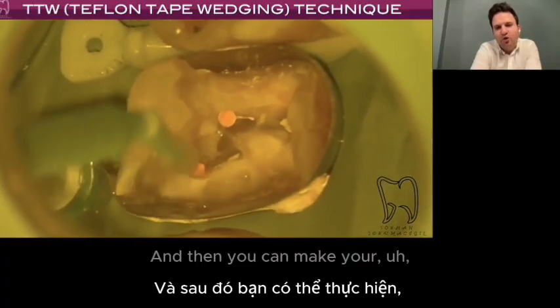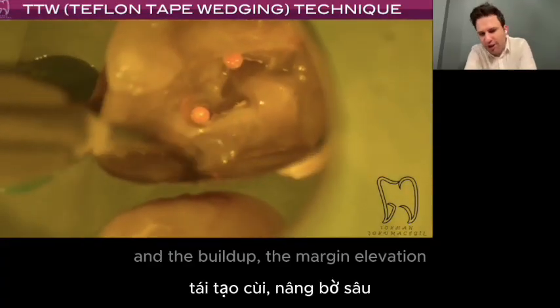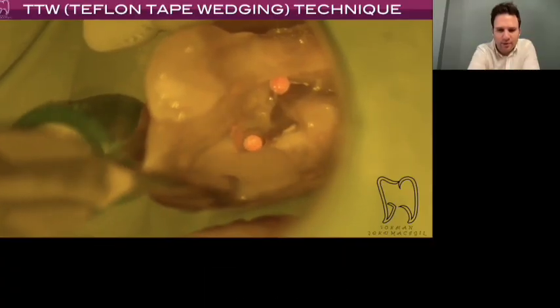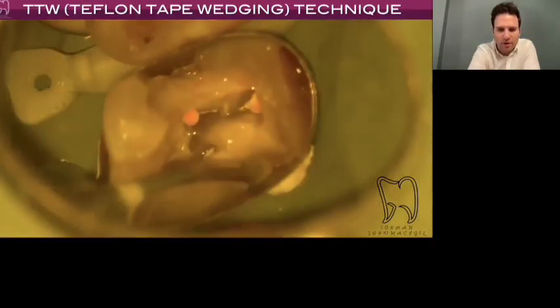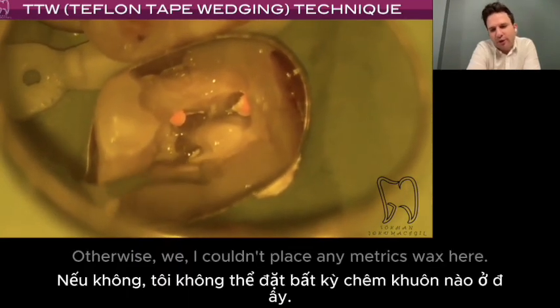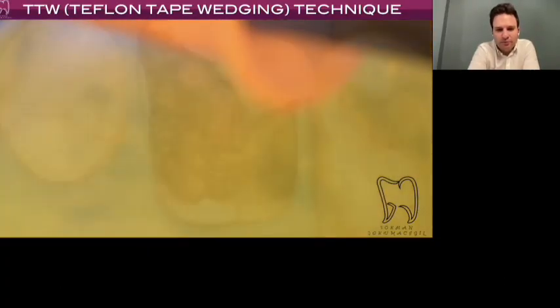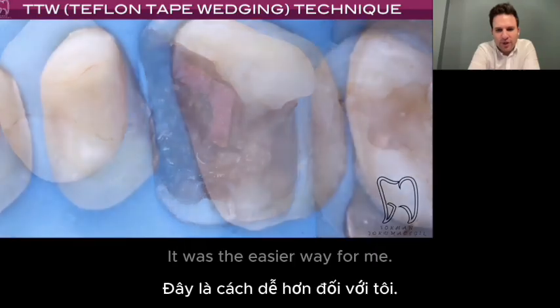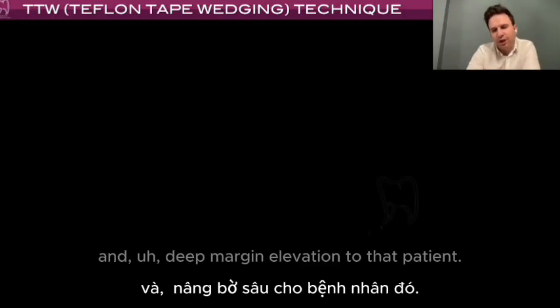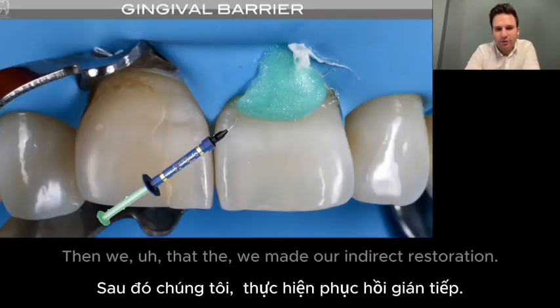And then you can make your pre-endo build-up and deep margin elevation by using the composite. Otherwise, I couldn't place any matrix system here. It was the easier way for me, and then I made the immediate dentin sealing and deep margin elevation for that patient. Then we made our indirect restoration.